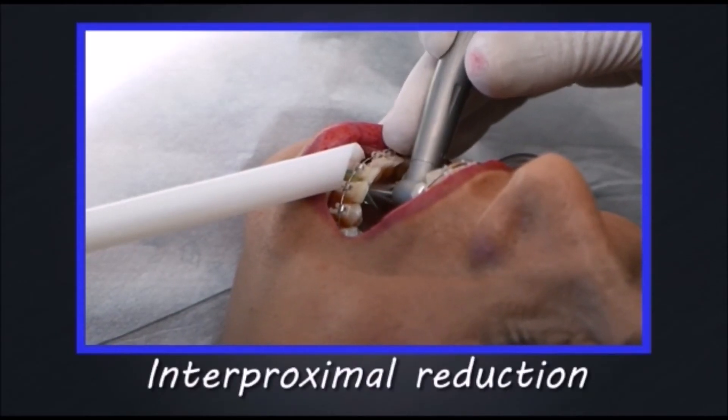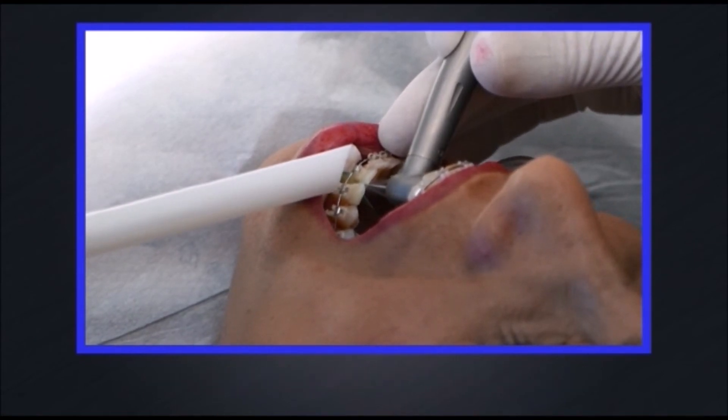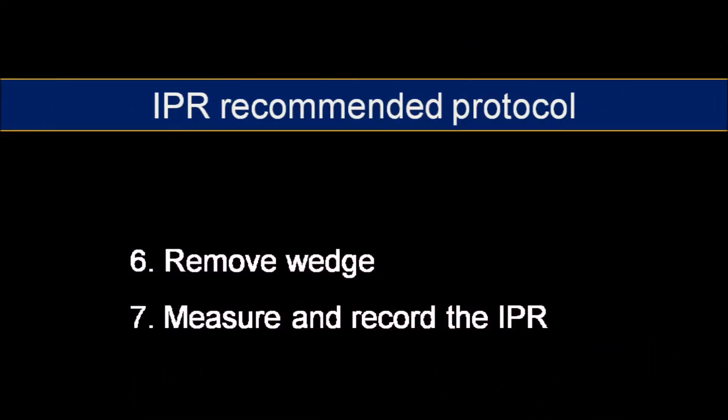In case of several areas to be treated with IPR, it is best to proceed one area at a time. When the procedure is completed, remove the wedge. It is important to measure and register the IPR.